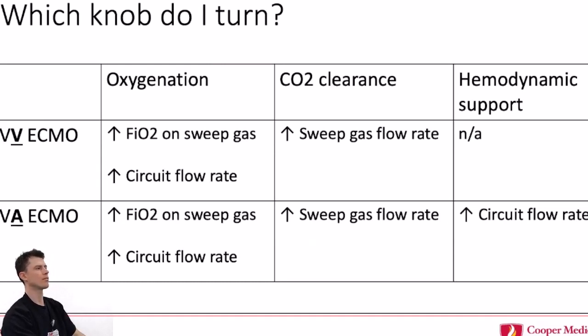Yeah, when you guys are titrating, do you base it off of just a normal pH? Because I've had patients where their CO2 is 90 and we don't care as long as the pH is normal. Is that typically how it is here too? That is a great question. I think there's been some practice variation in that, and our thought process has probably changed some as we've gone through iterations of patients that we've taken care of.